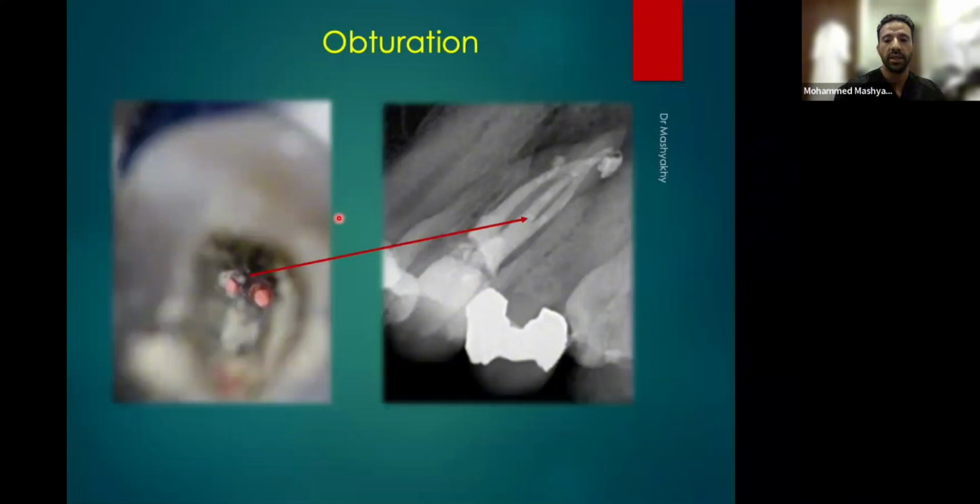I cut deep here. I put one cone and I cut it, and I put the other cone and I cut it like this. Then I fill with the injectable gutta percha with the help of a microscope. So in some cases, you have to know your limitation. If you cannot fill it yourself, just refer it to the specialists who have the material and the instruments, okay?